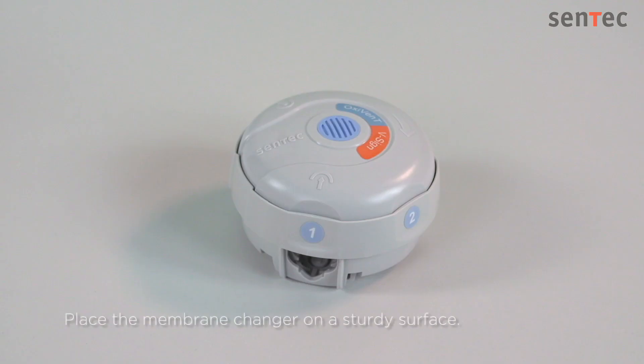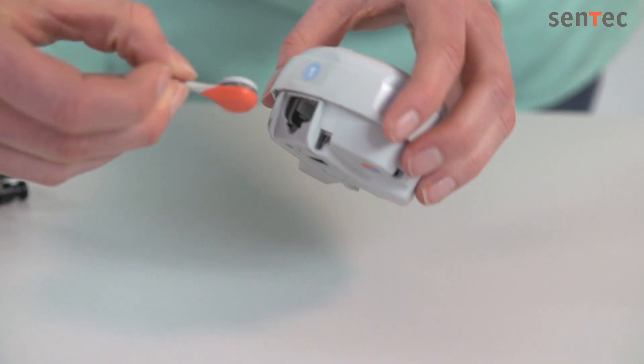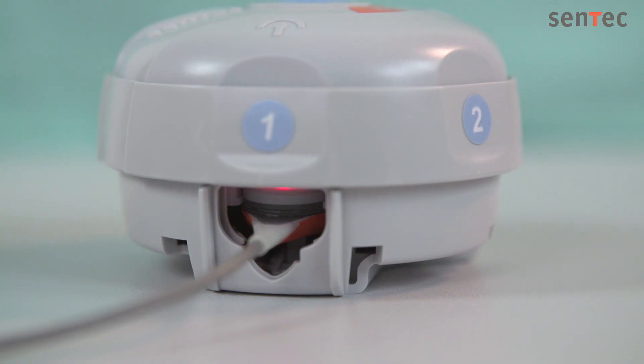First, place the membrane changer on a sturdy surface. Insert the sensor into the receiver with the sensor side facing up and then execute the following four simple steps while standing.